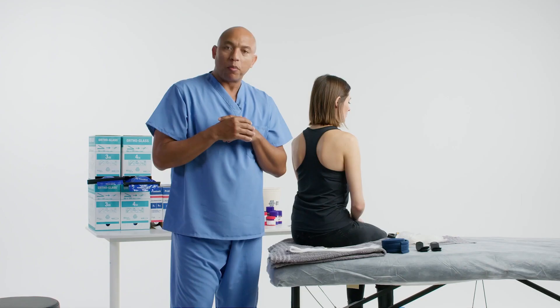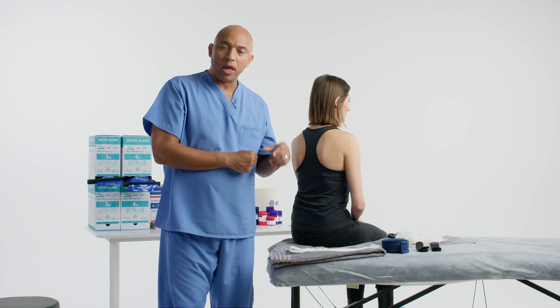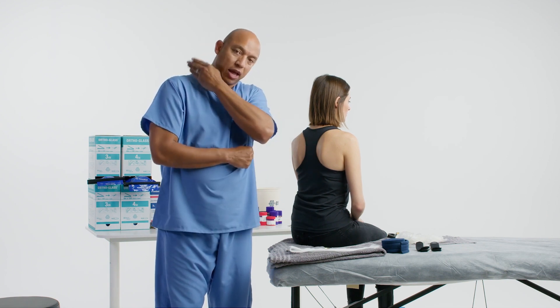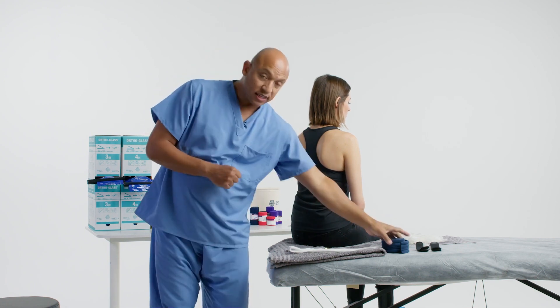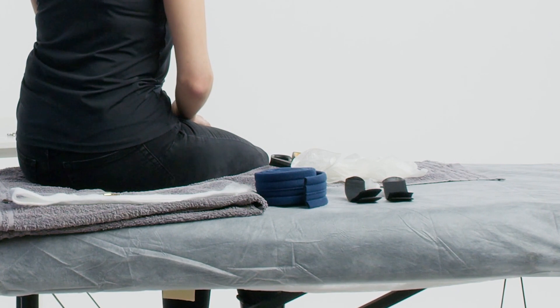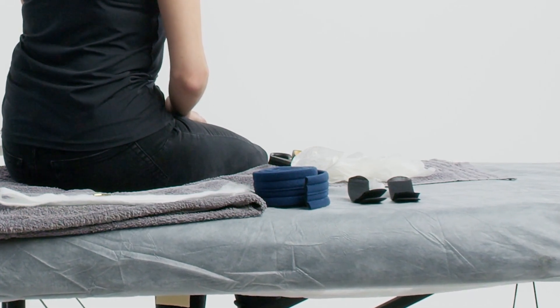There are different ways to apply it, but we're going to use sling on a roll, and what we're going to do is counterbalance that arm by attaching the sling portion to the ortho glass splint at the proximal end and bring it around the shoulder with this nice comfortable material. An alternate way is using a stockinette, which stretches and really irritates the back of the neck. Let's begin.